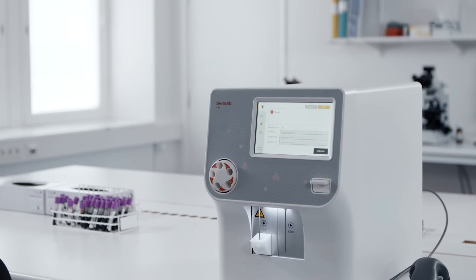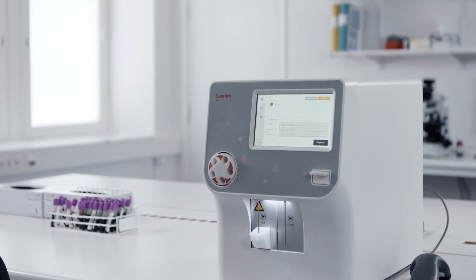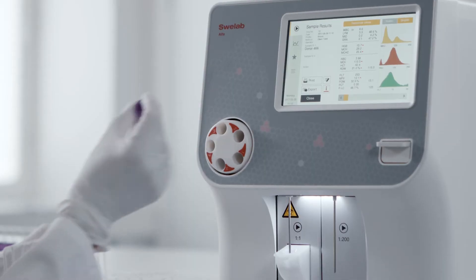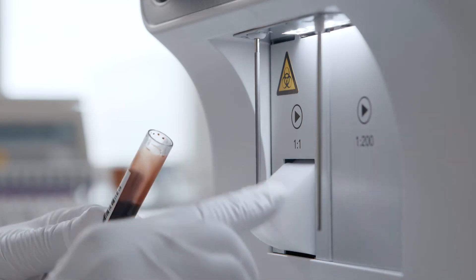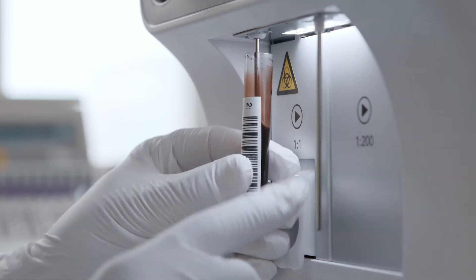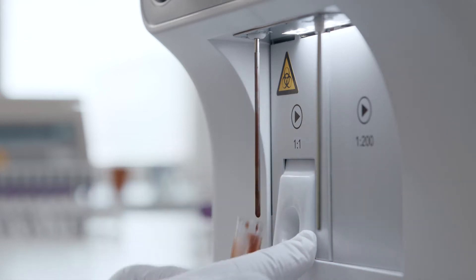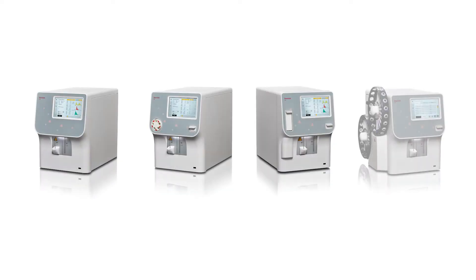Swelab Alfa Plus three-part differential haematology analyzers are built around the well-proven attributes of accuracy, reliability, and simplicity. Featuring the latest technology updates, they make it even easier to rapidly obtain, analyze, and share accurate haematology data.